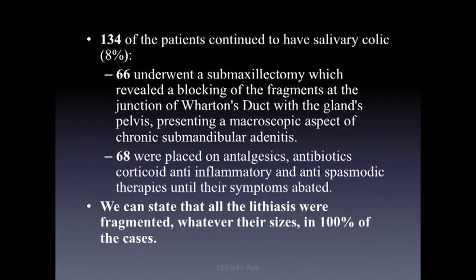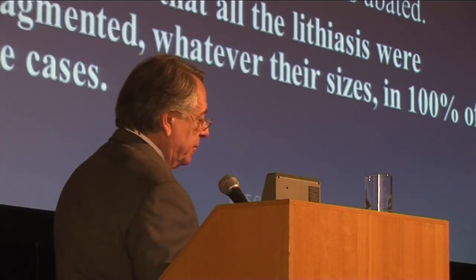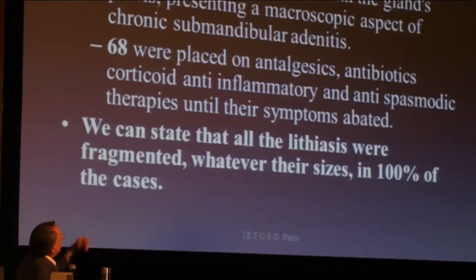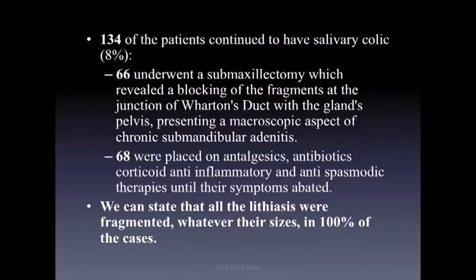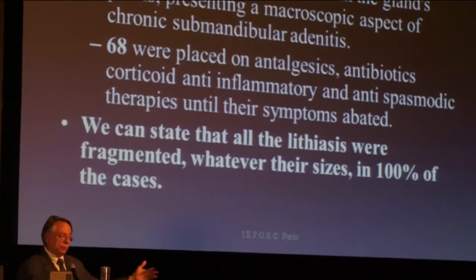We have, like said Pasquale, 8% of patients who continued with salivary colic, and 4% of the patients had a submaxillectomy, that's plain surgery, and 68 were treated with analgesics, antibiotics and corticoids. But we can say that all the lithiases were broken. That means 100% of the lithiases were broken with the lithotripsy. We know exactly how to break the stone, but we don't know exactly how to remove the fragments.